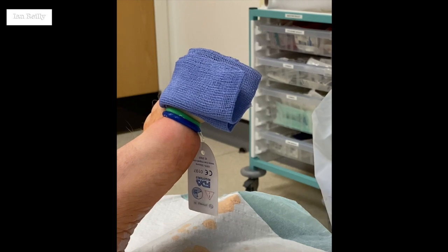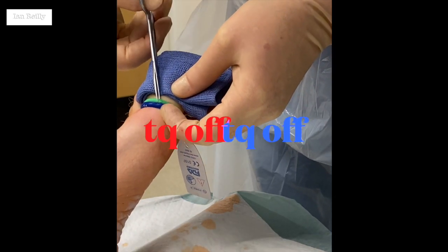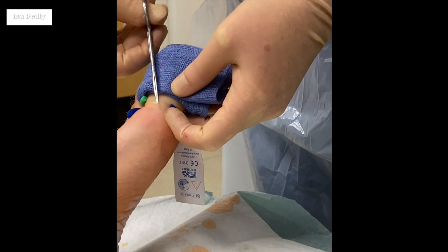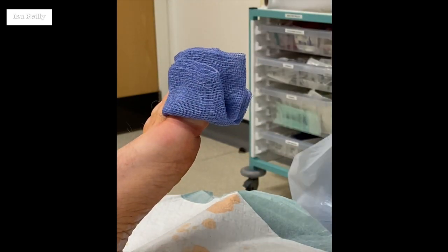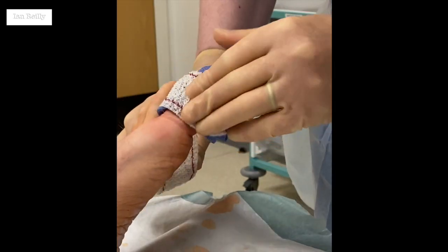We've got one suture to put in the sharps, apart from everything else. And then we're just going to tourniquet down — that's now 43 minutes. Check for revascularisation, make sure that doesn't do anything cheeky — that's all coming back nicely. And then we put on our crepe bandage. So that's it out.